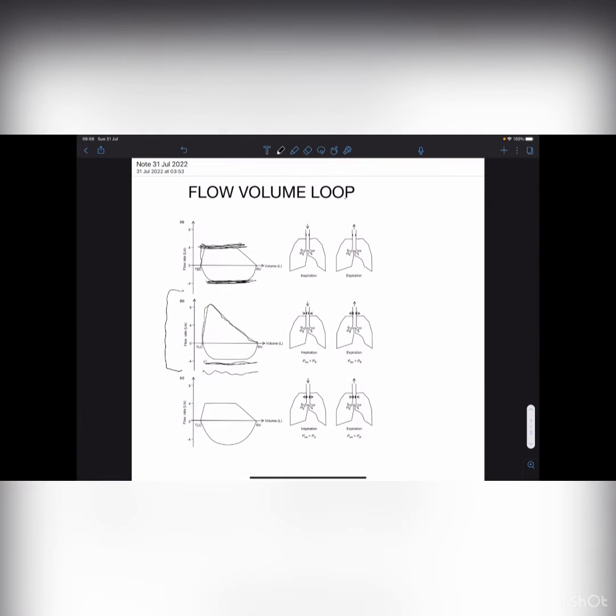For that reason you will not see the flattening of the curve in this part. In our clinical practice, you might have seen patients suffering from laryngospasm soon after extubation, where they have great difficulty during inspiration, but during expiration they do not have the airway obstruction. So in those patients, you will hear a sound which is called a stridor, and that will give the flattening of the curve during the inspiratory curve.